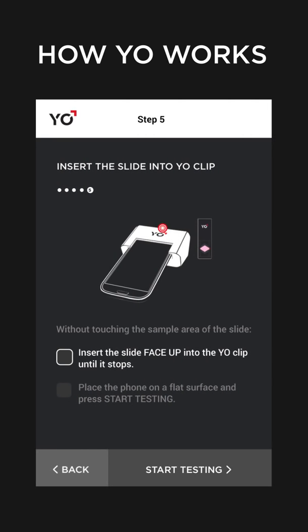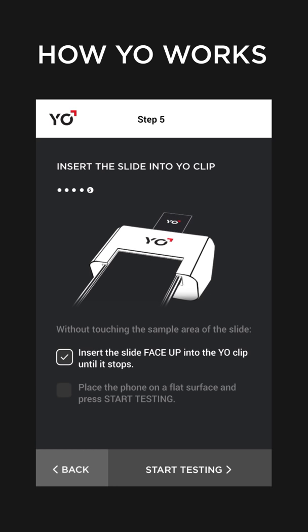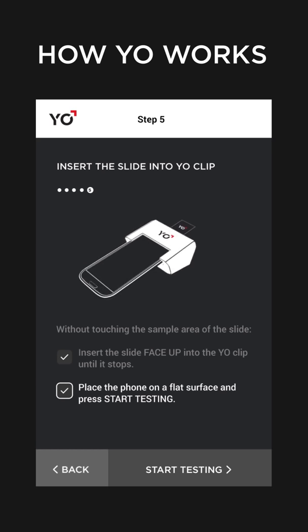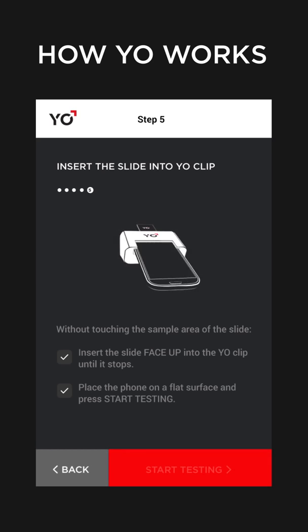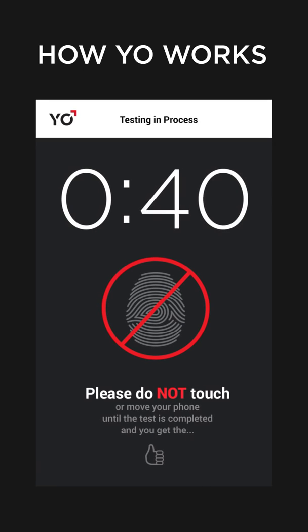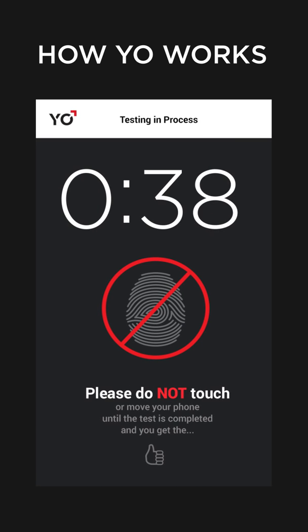Insert the prepared slide face up into the YO clip. Tap Start Testing. YO will now take a video of your sample.